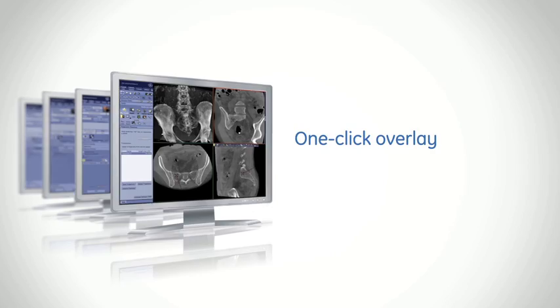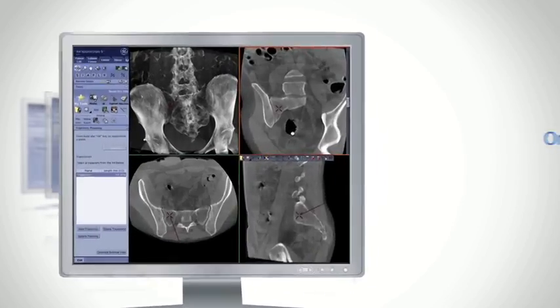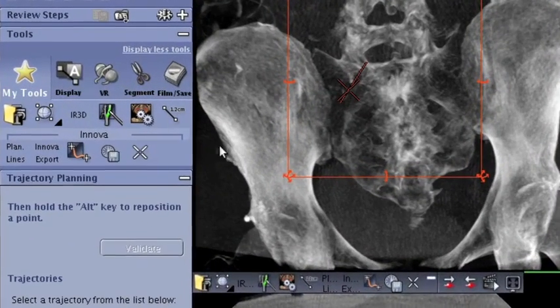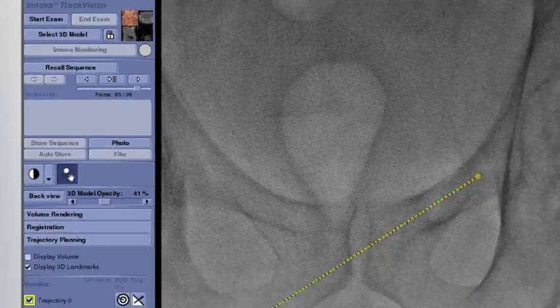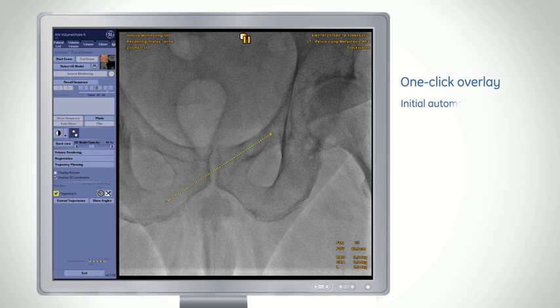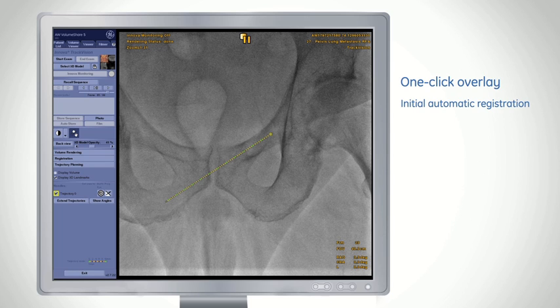Innova Track Vision overlays these trajectories on fluoroscopy in a single click to provide live 3D needle guidance with initial automatic registration.